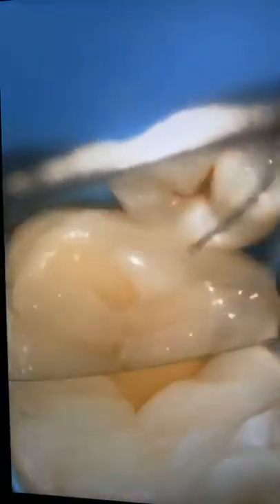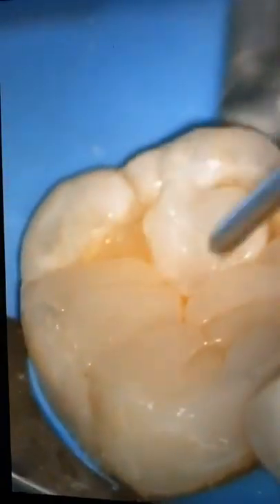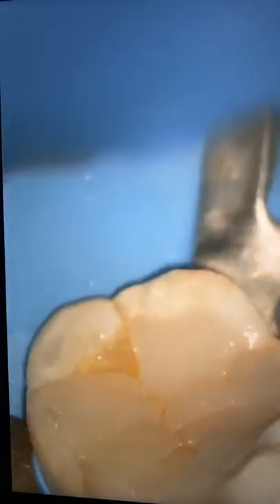If you notice some gap here, I will close it later with my flowable, or if you want, you can use stain, yeah, the brown stain or the ochre stain to recreate the natural stains.